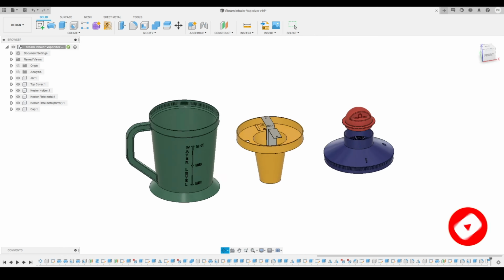Here you can see by providing this dimension, 55 millimeter, I had defined everything. Whatever dimensions were needed to define this sketch, I had provided. So I will just adjust it a little bit to make it in the right orientation. Here you can see I just defined it correctly. This is the completely defined sketch right now on your screen.